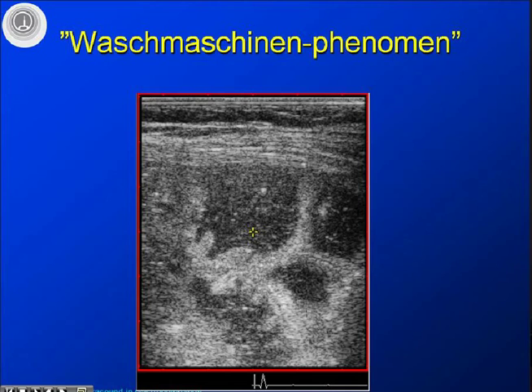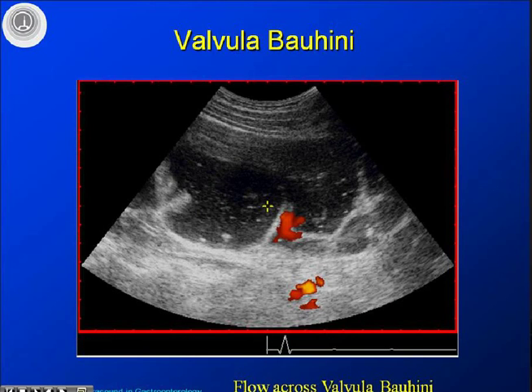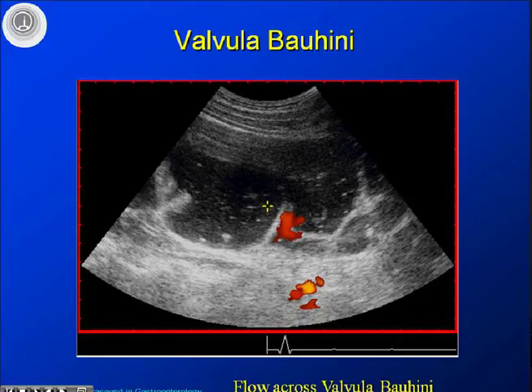Hypermotility — this is one example of how the intestines contract too actively. Typically this is seen in a long-standing non-treated celiac patient. The Germans have a saying: the washing machine phenomenon — it's like looking into a really fast-running washing machine. Moving further down, this is the valvula bauhini, where you can see the distal ileum coming down into the cecum. Using Doppler you can even appreciate how flow goes to and fro over this valve, with great temporal resolution.